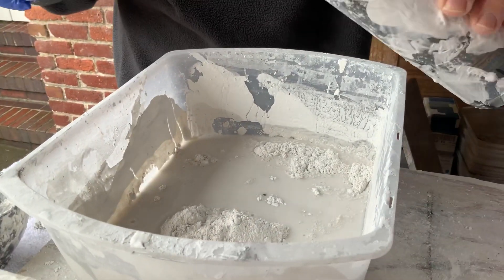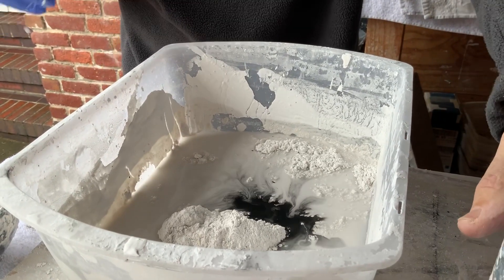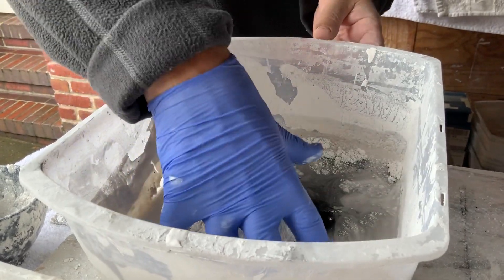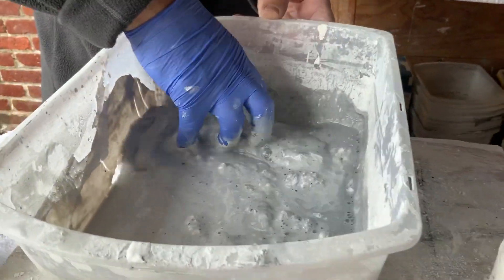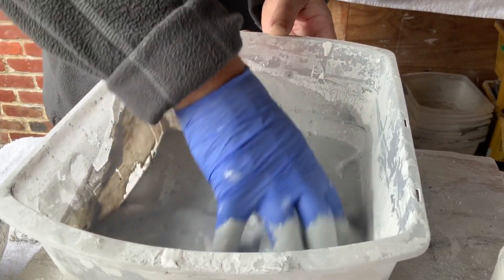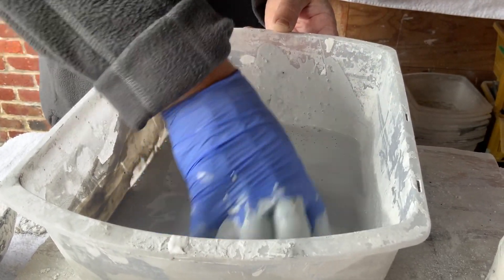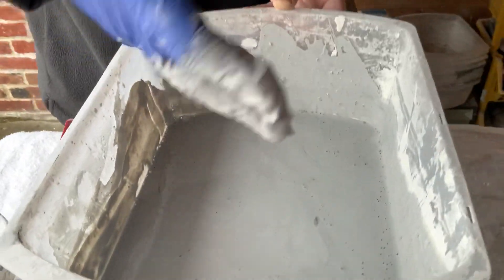I use a dye — just a little drop — to make the positive casts a slightly different color than the plaster we're going to use later on. Then we get rid of all the granules and make sure it's just a smooth solution. Now it's a nice even solution. That's the reason for my glove.